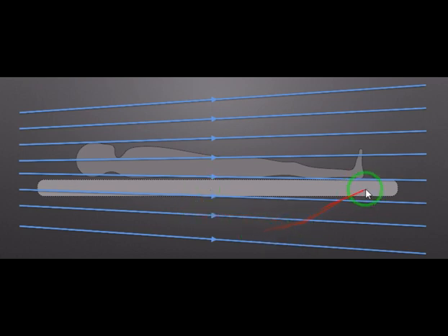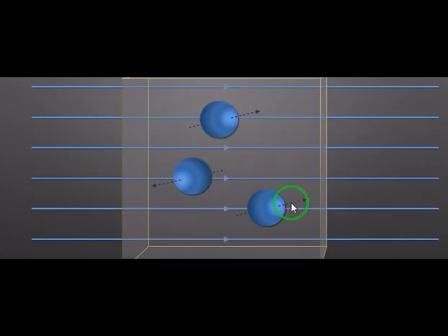Now when we are in that hole and the externally applied magnetic field is present, our water molecules, the hydrogens to be more precise, will align themselves with respect to these magnetic lines. And here you can see what happens, that the hydrogens will align their magnetic spins parallel to these magnetic lines.